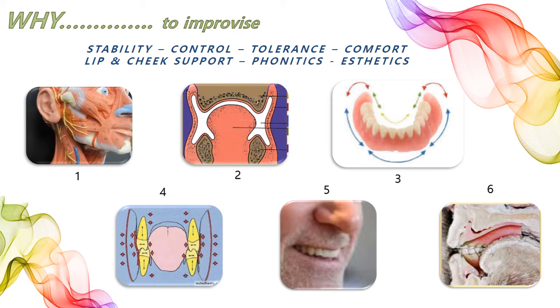So the dentures are contoured in such a way that these internal and external musculature need to be accommodated properly to improve the stability. When it comes to the stability aspect, always the lower denture stability is compromised because it is surrounded in 360 degrees with different musculature.